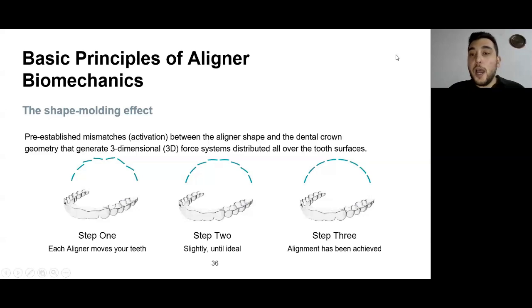So what I want us to deduce from what we've mentioned so far about clear aligners and the difference between clear aligners and fixed braces, I want us to remember two points: that we have a material difference. The material that is used for clear aligner movement is relatively a little bit weaker. And we also have an absence of direct points of contact.